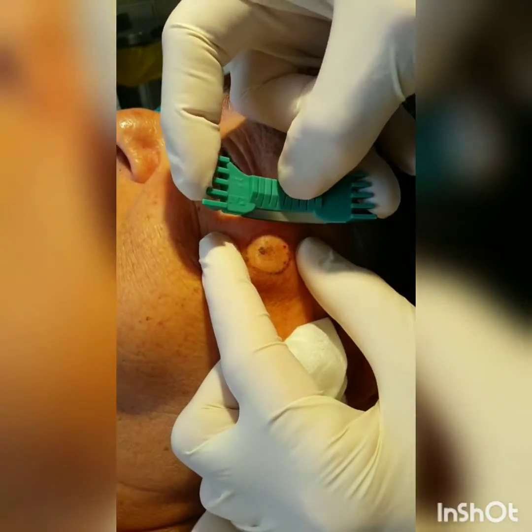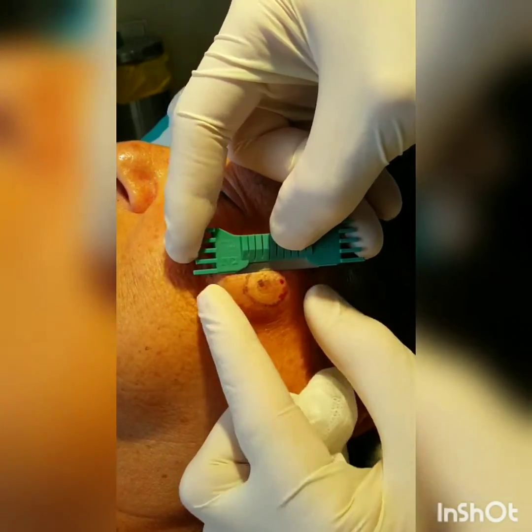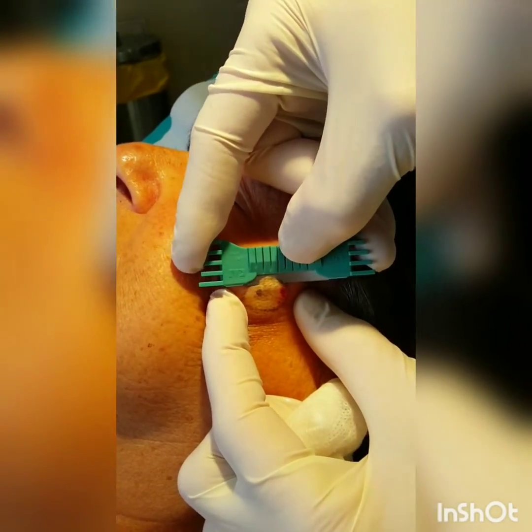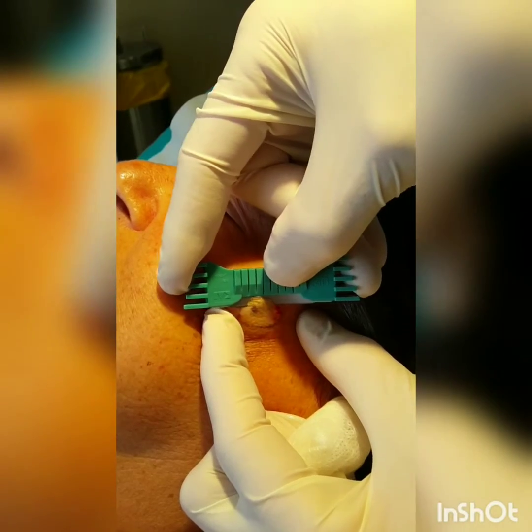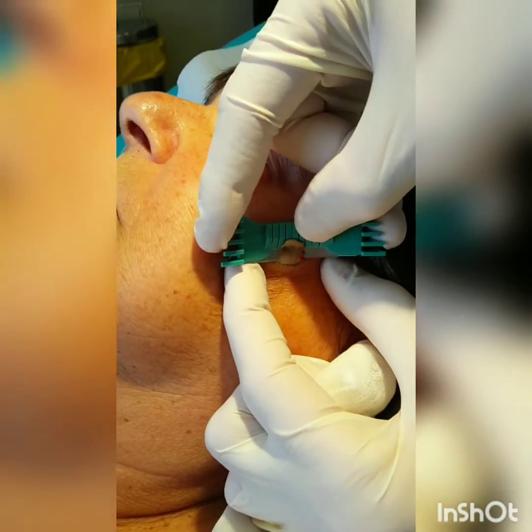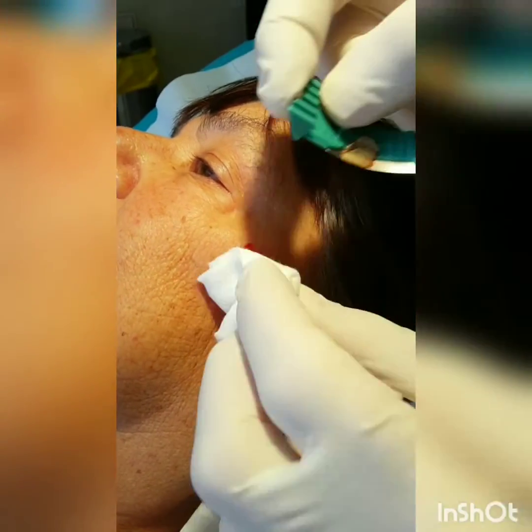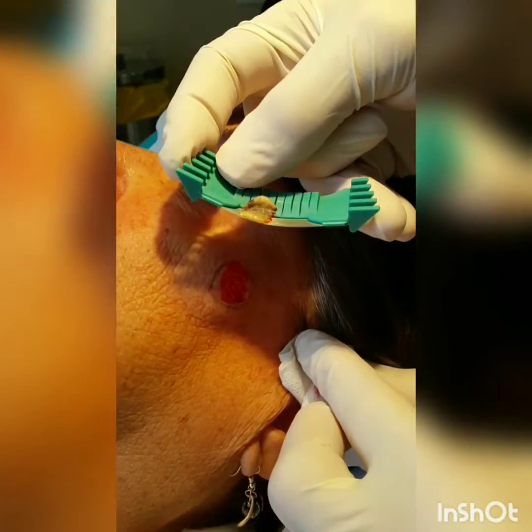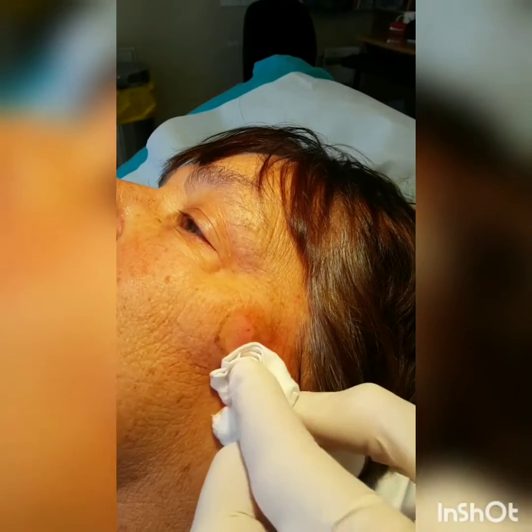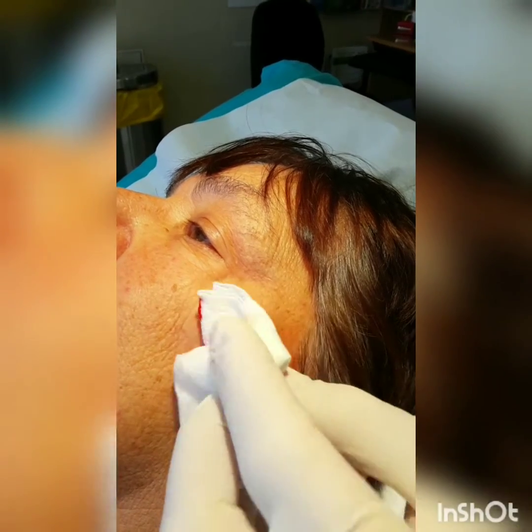Now, keeping the skin taut between two fingers, we'll proceed to remove the pigmented area. We are making every effort to remove the entire pigmented area in one go, being careful to have adequate depth but not too much depth — as if it is a melanoma, we do not want to transect the deep margin, which will result in distortion of the Breslow thickness and prognosis.